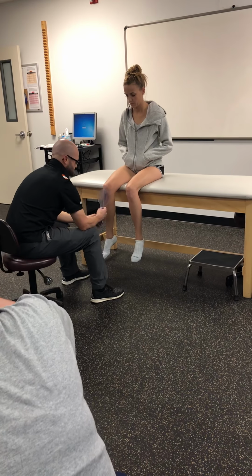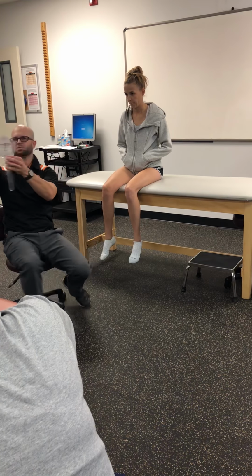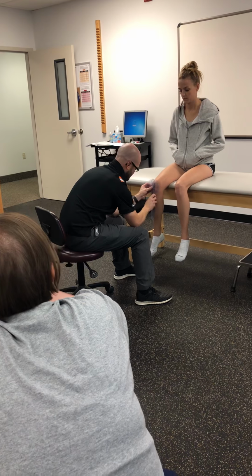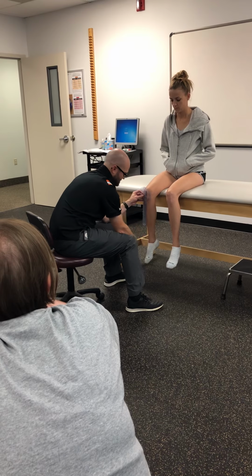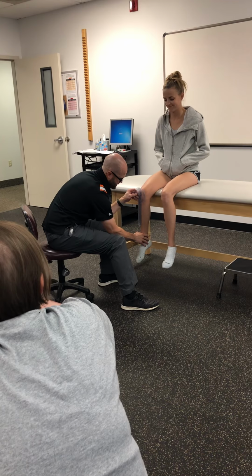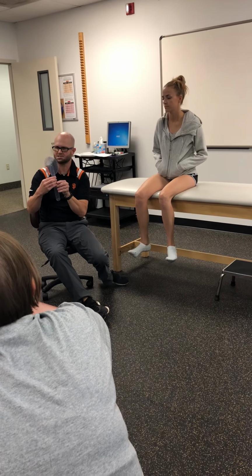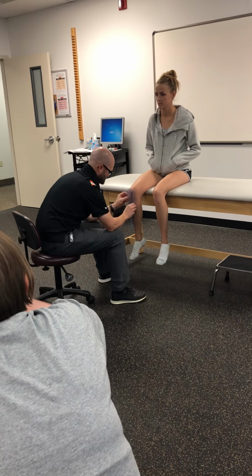Now, just like abduction and adduction of the hip, it doesn't necessarily matter if we start, and you'll find this to be common, as far as our starting position, it doesn't have to be right at zero. So if I'm coming up here and I get all lined up, and say she's just in a resting position in slight external rotation, I don't have to say, no, you start here, and then do the motion. I just know that for my documentation, the only numbers that matter are the ones once I get to that zero and start passing it. So, let's do the measurement.